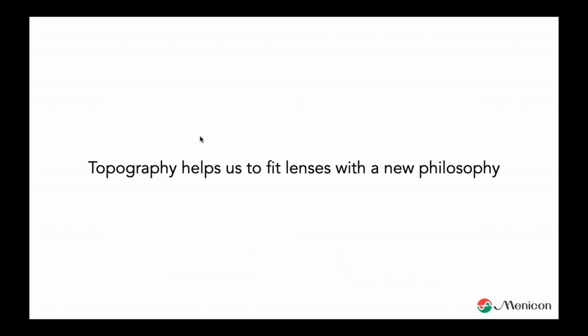Another thing is that topography, as I already mentioned, is helping us to fit lenses with a new philosophy. And yes, we all fit lenses by K readings, and people who have already seen my lectures about the scleral lens already know that I really believe we have to not use K readings anymore. We have to look differently at lens fits. And again, that's in the beginning stage. There are not many lenses out there with that philosophy, but that will change in the future. So it is very important to understand topography because it will become more and more important in the near future.